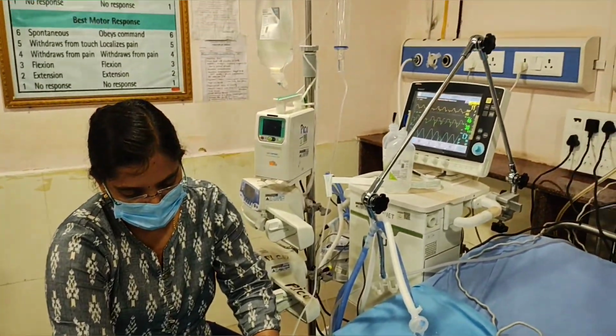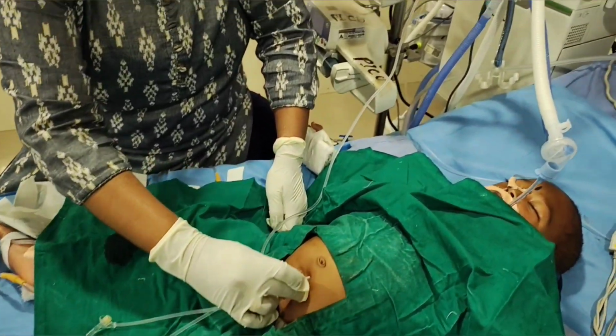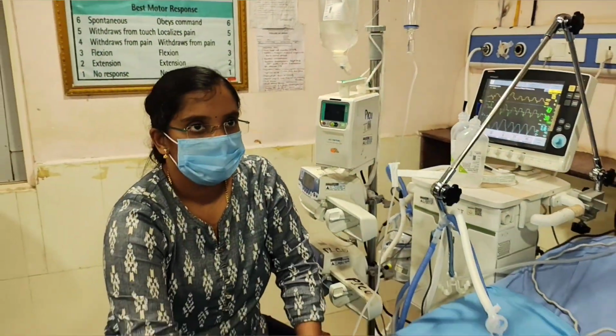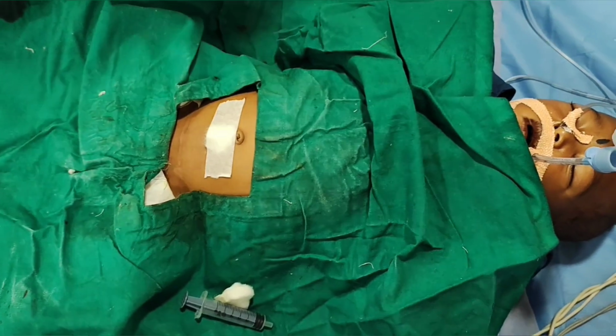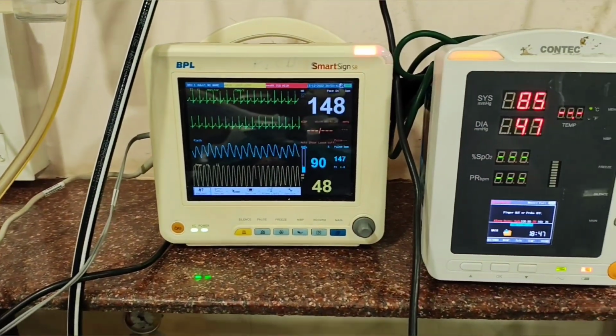Now the peritoneum is primed with peritoneal fluid around 20 to 30 ml per kg. Here we infused 20 ml per kg, around 200 ml of peritoneal fluid. PD fluid is in the peritoneum.